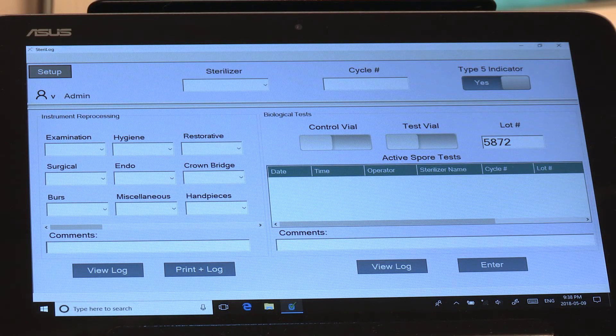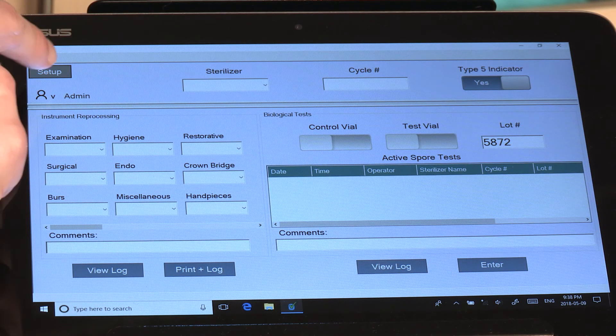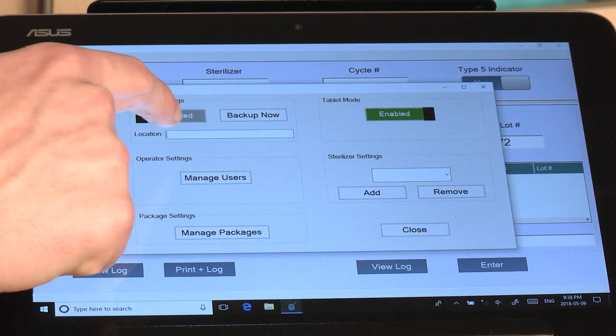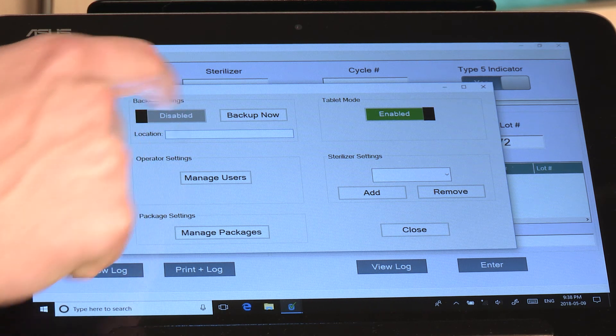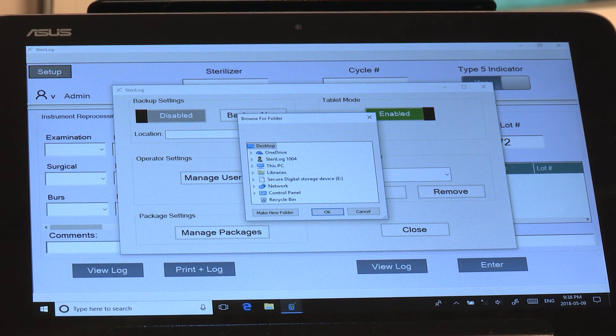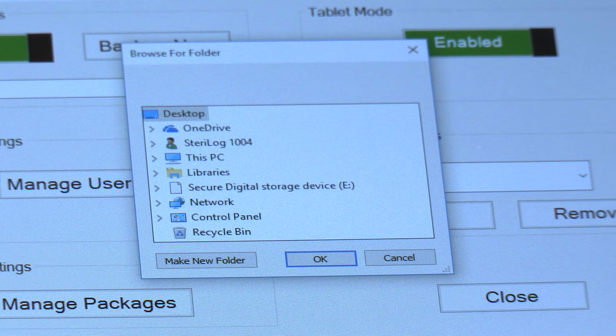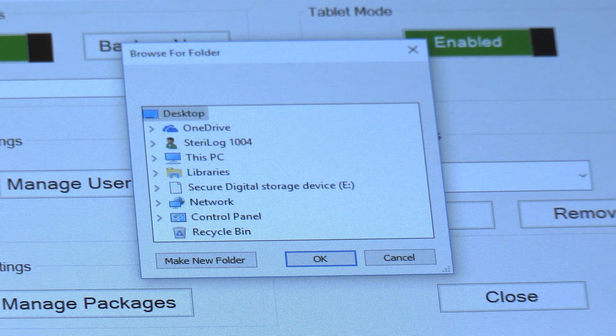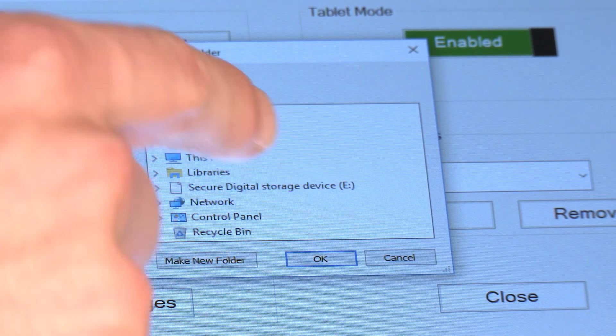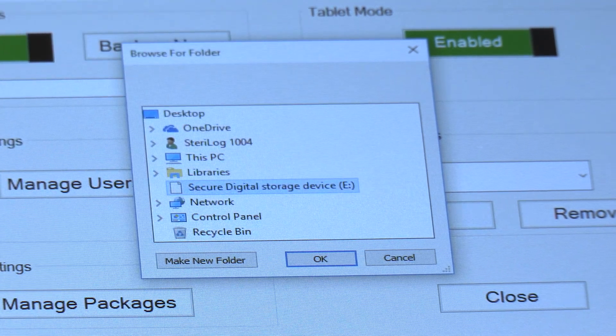To set up the backup location for your logs, hit Setup, then click on the location field here and you'll see a dialog will pop up. You can select the backup location for your data logs from this dialog, so we can select the SD card which is provided with the system.